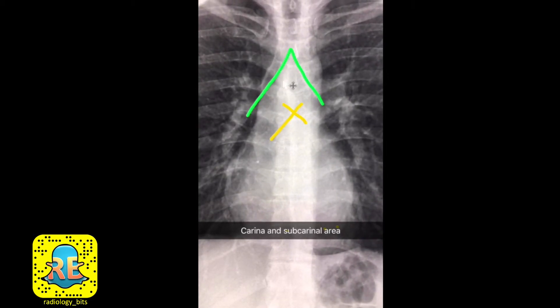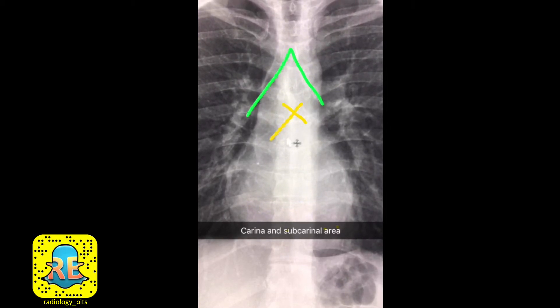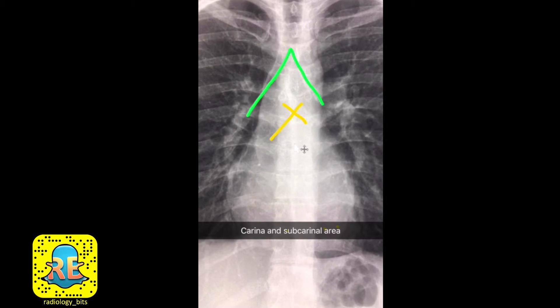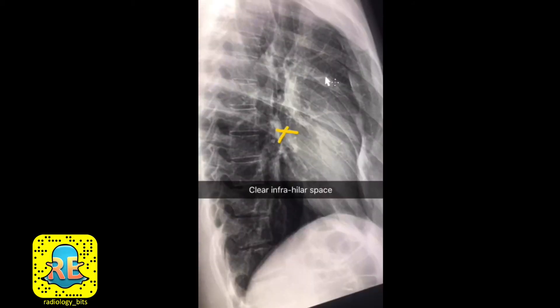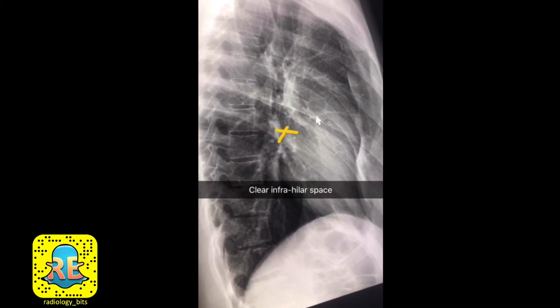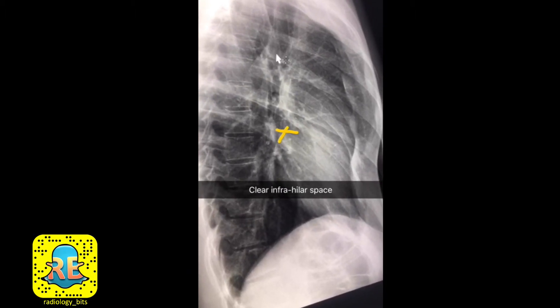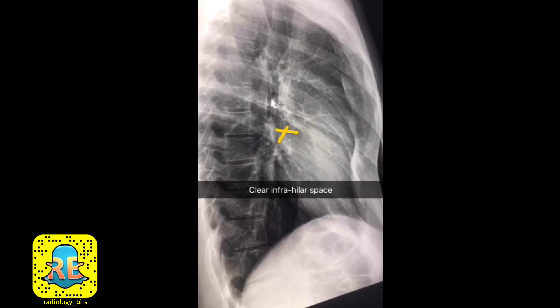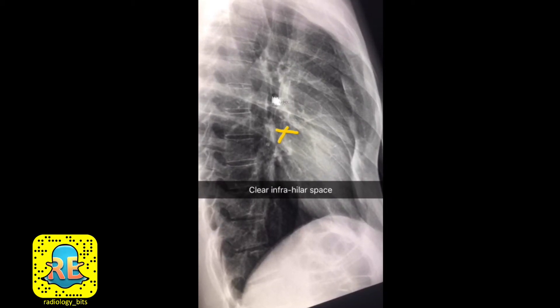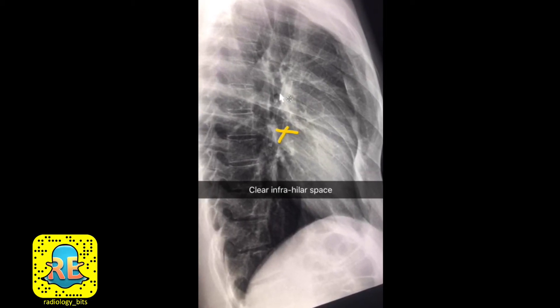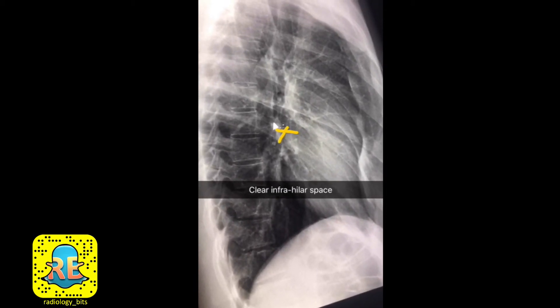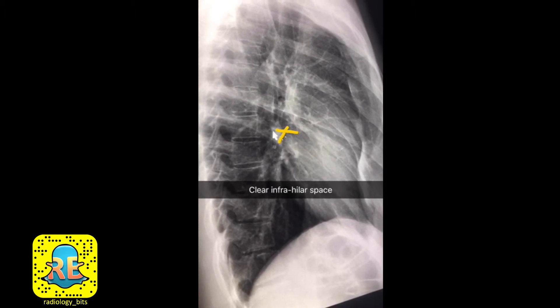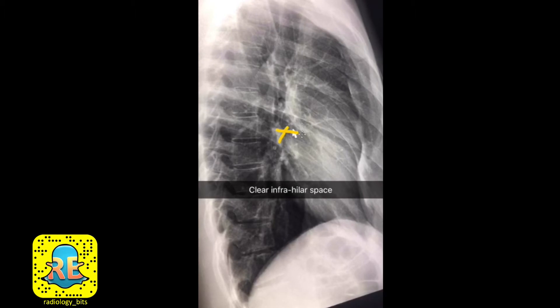The third area to concentrate on is below the bifurcation of the trachea, known as the carina — specifically the subcarinal region. You should not have any masses here, detectable by looking at the density of the radiograph. On a normal lateral radiograph, you can see the trachea and hilar structures. The region below the hilum is typically a clear, relatively dark area with no opacities.